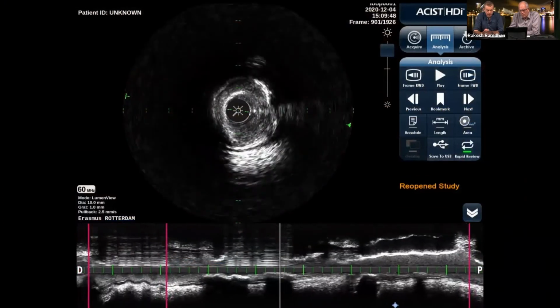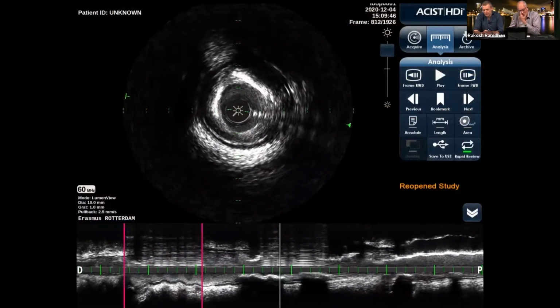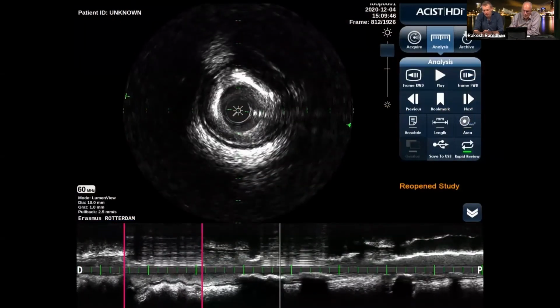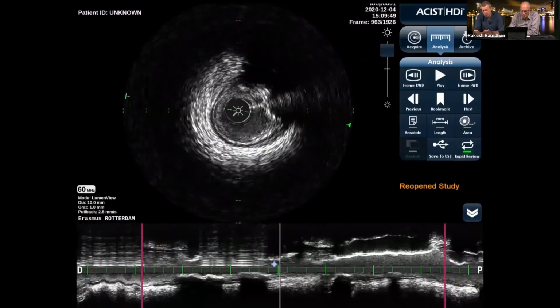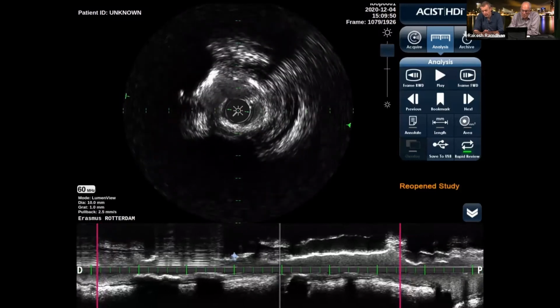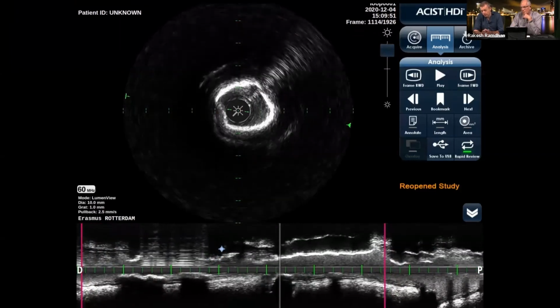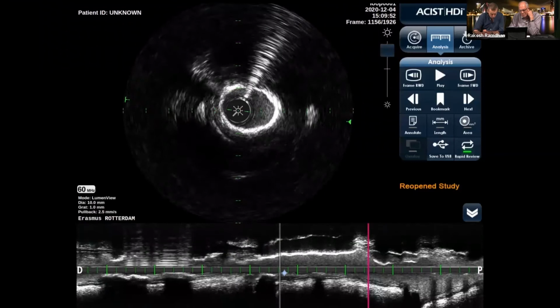Yeah. But again, we have a patient with anterior ST segment elevation. We have a very tight calcified lesion. And we have a ruptured plaque in the proximal LAD that is non-thrombotic, non-luminal obstructive, and it is questionable whether that was the culprit of this STEMI or not. So that is left open.